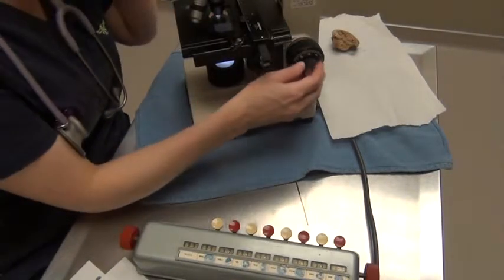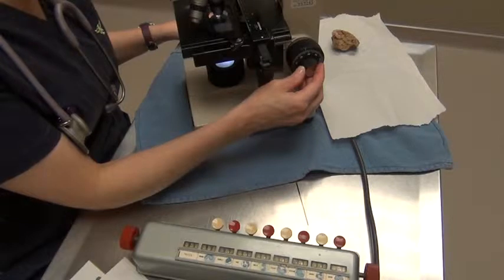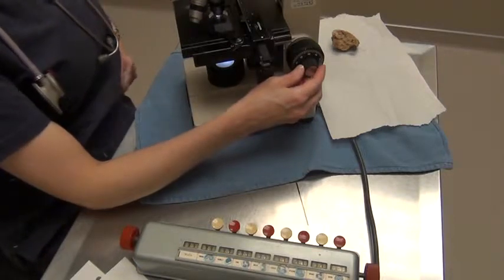I've got several things going on this slide. I do notice a lot of polychromasia. There are some cells that have central pallor. There are some that don't. I do see a lot of acanthocytes. They've got a lot of different shapes in here.